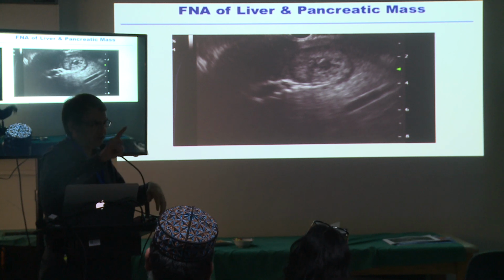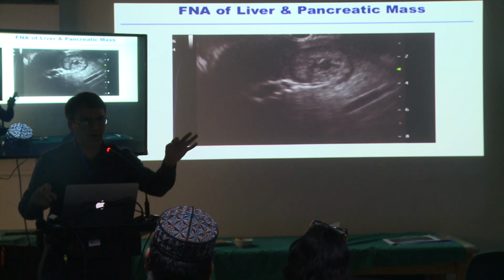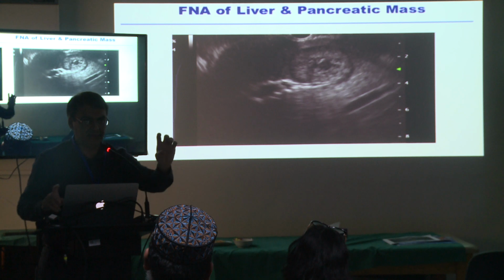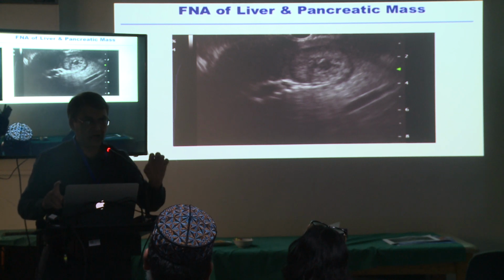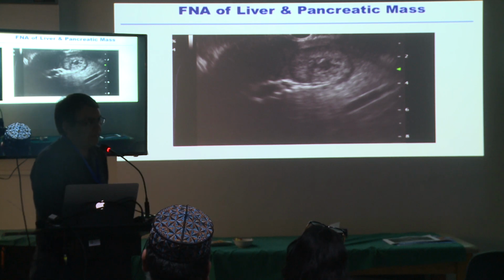And actually, there is another way to get pancreatitis. If the lesion is way too far away from you and you have normal pancreatic tissue in between the lesion and the gastric or duodenal wall. My question is, in any case, we are going to go through two ducts.